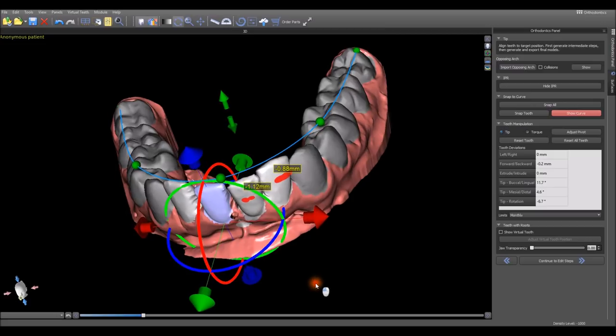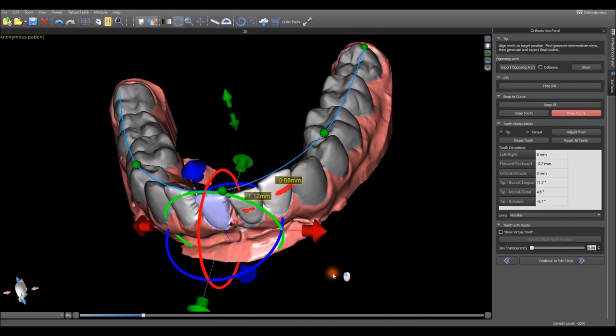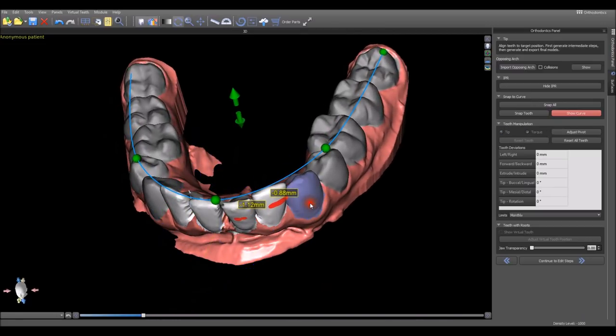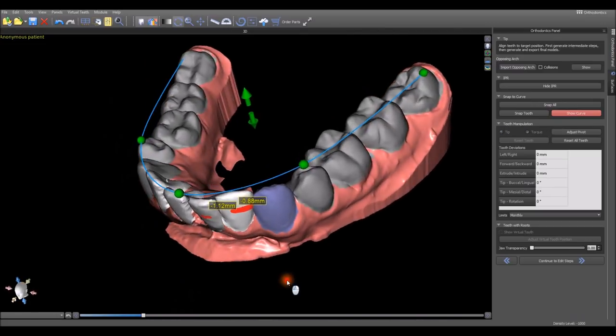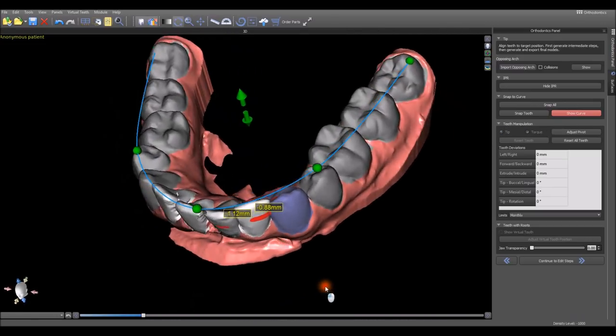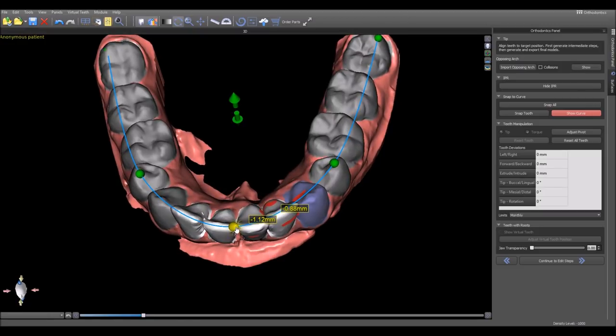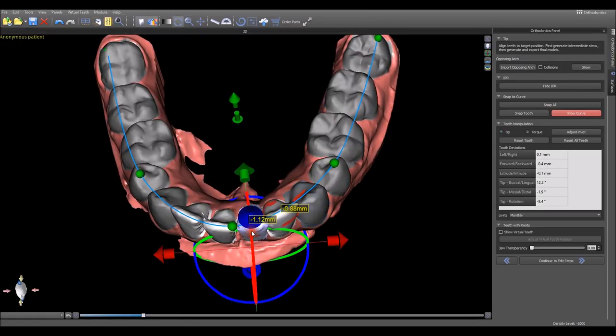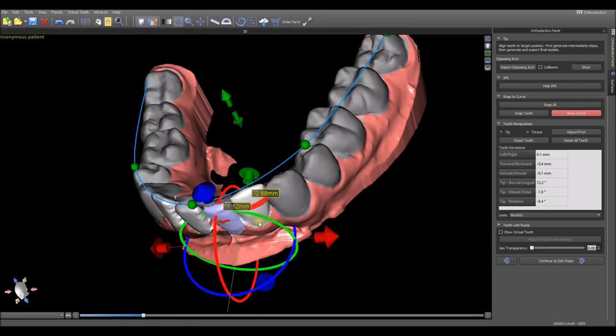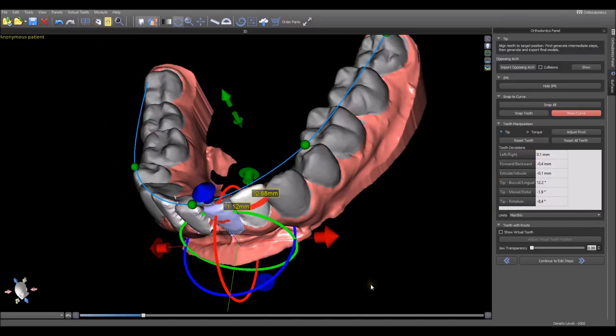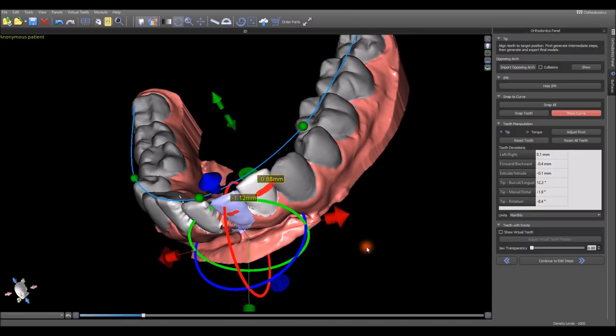If you'd like to hide the widget, just left click on one of the inactive teeth and the widget will disappear, giving you better access to the curve. For any given tooth when it's clicked upon, you can see the statistics about how much the tooth was moved and in which direction. You also have the option of manipulating the tooth based on the tip or based on the torque.